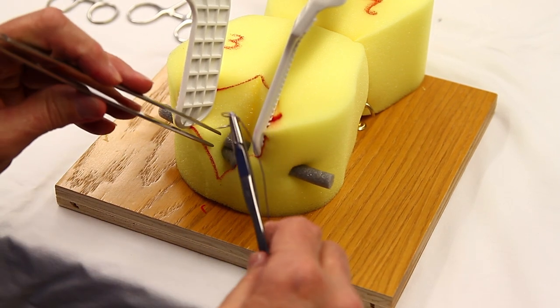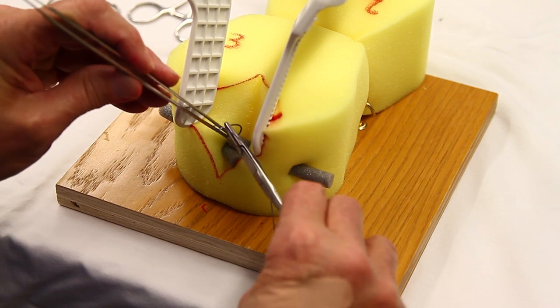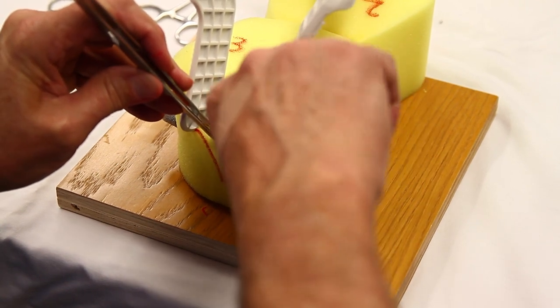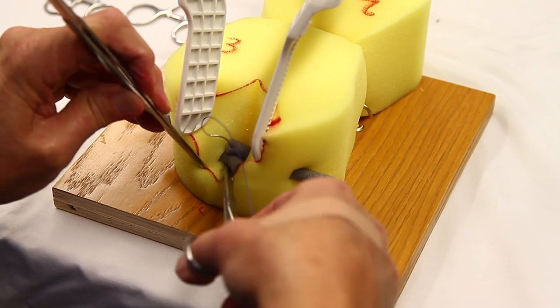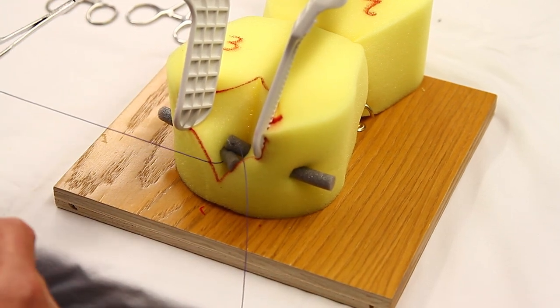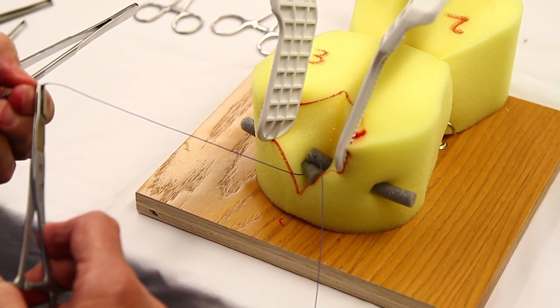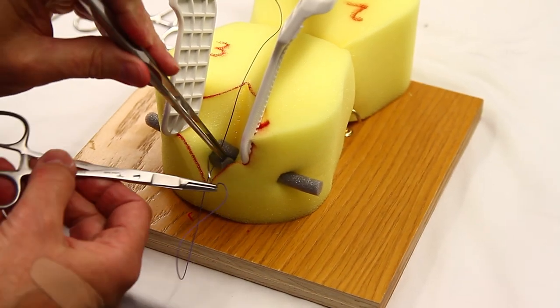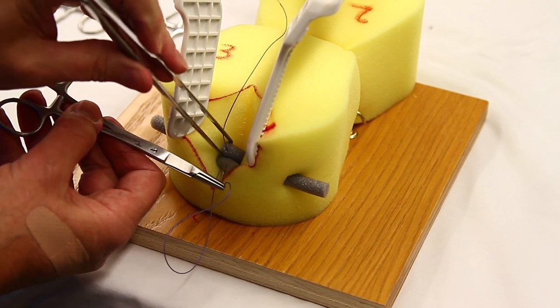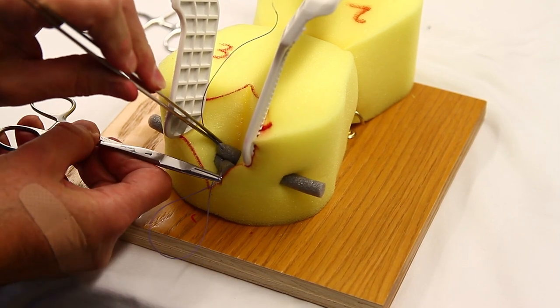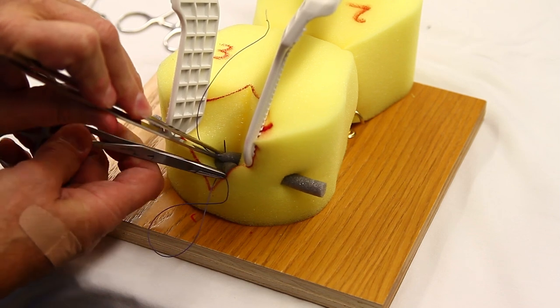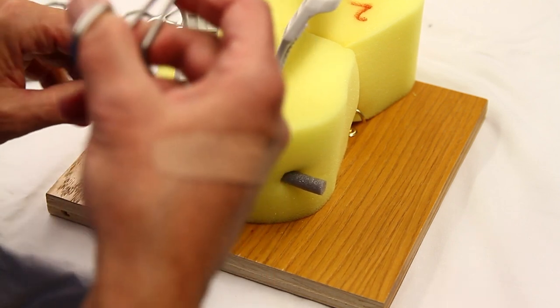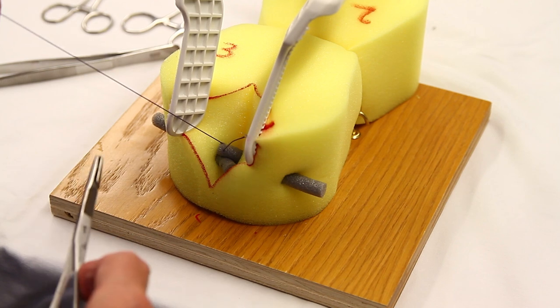The repair for this portion, start on the top, go through and through the rectal sphincter and through and through the bottom one. Pick up the needle. This is our same suture. It's a CT1 needle and typically 2-O or 3-O vicryl. And we're going to go right back up through and through both sides and then we're going to tie that.